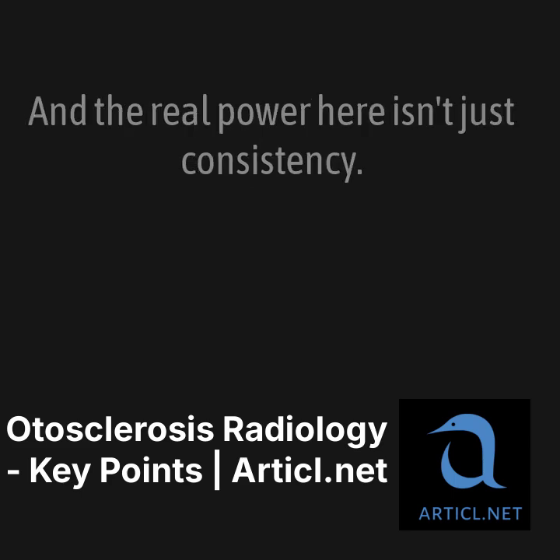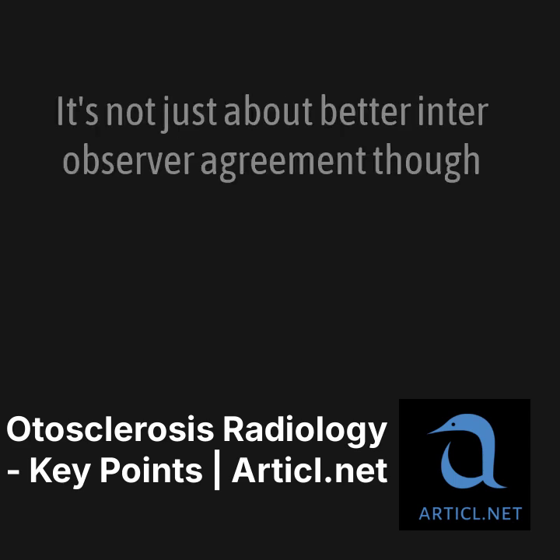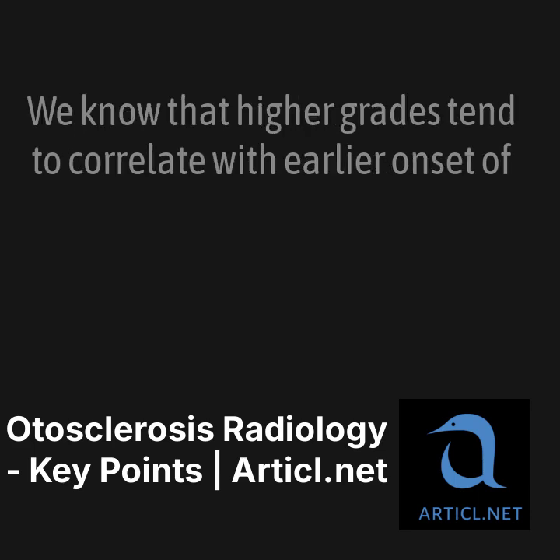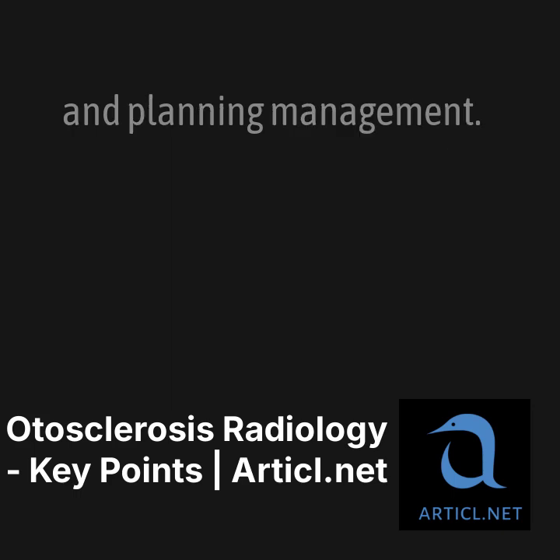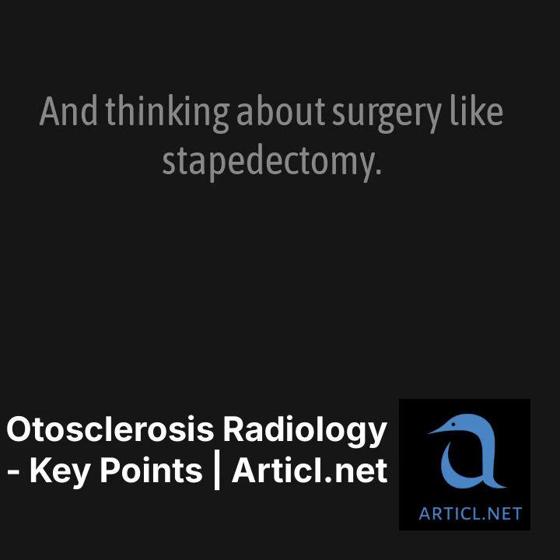And the real power here isn't just consistency. Exactly. It's not just about better inter-observer agreement, though that's good too. It actually turns HRCT into more of a prognostic tool. We know that higher grades tend to correlate with earlier onset of SNHL and increasing severity. Which is invaluable for talking to patients and planning management, like deciding about cochlear implants. Absolutely. And thinking about surgery, like stapedectomy.